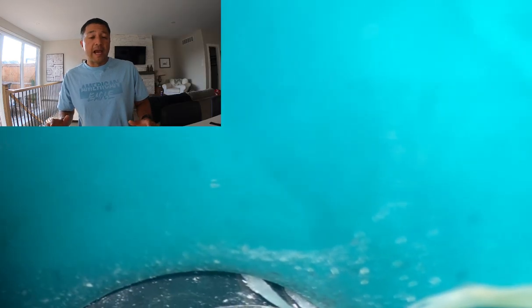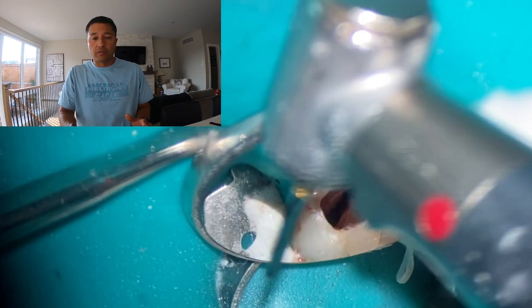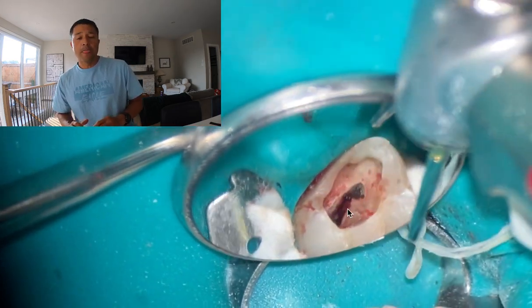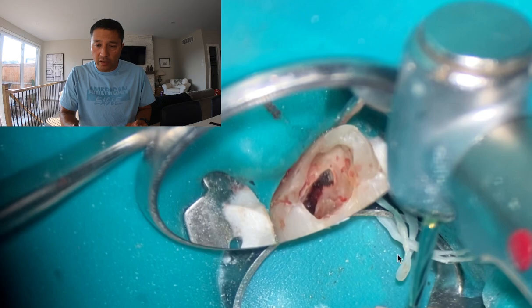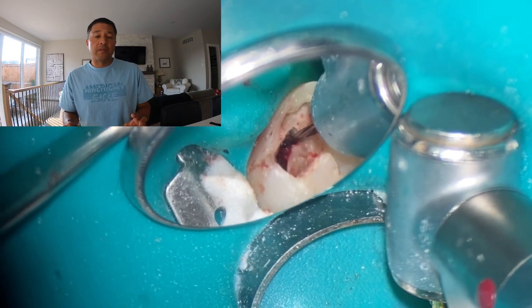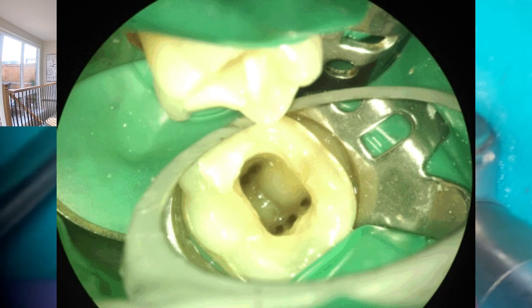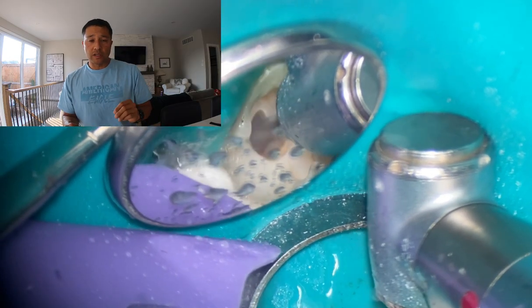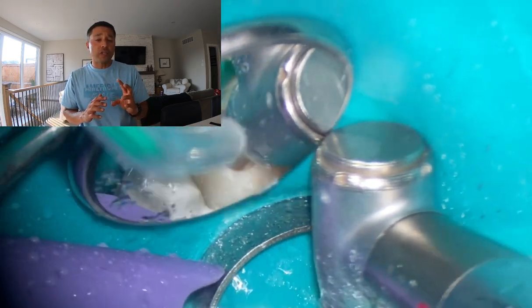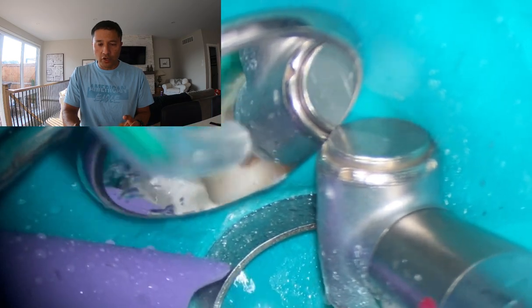I'm just pushing the pulp tissue to make sure we're in the pulp — it's not osseous tissue. Then I'm going to take my endo Z bur. All I wanted to do is unroof from the mesial buccal to the palatal, and now I'm going to take my endo Z bur — it's a non-cutting tip, a rounded tip. There are a whole bunch of different brands, diamond-coated ones; we've just been using these for years. I'm going to spin it at 200,000 RPM and place that right to the bottom at the top of the pulpal floor, and that bur is just going to follow around. My dental assistant is doing a great job blowing air so I can see what's going on in the mirror. With an endo Z bur it's really hard to see; I'm watching and feeling what's going on.